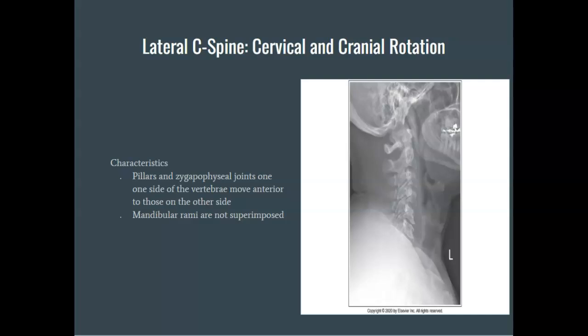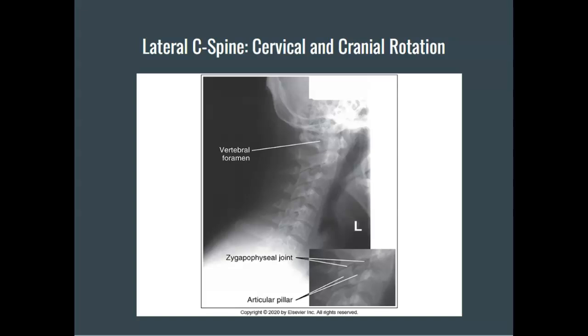You also want to ensure that the interpupillary line is also perpendicular with the IR to ensure that there is no rotation in the cranium or head.